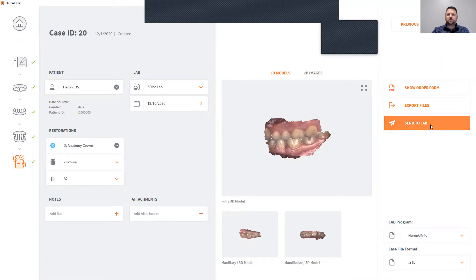This is also where you will click to send your cases to your lab. All you do is simply click send to lab. You can also change the file format in which you send your file to your lab — you can change it from STL, OBJ, or PLY. Click send to lab, click OK, and now your case is on its way to the lab.